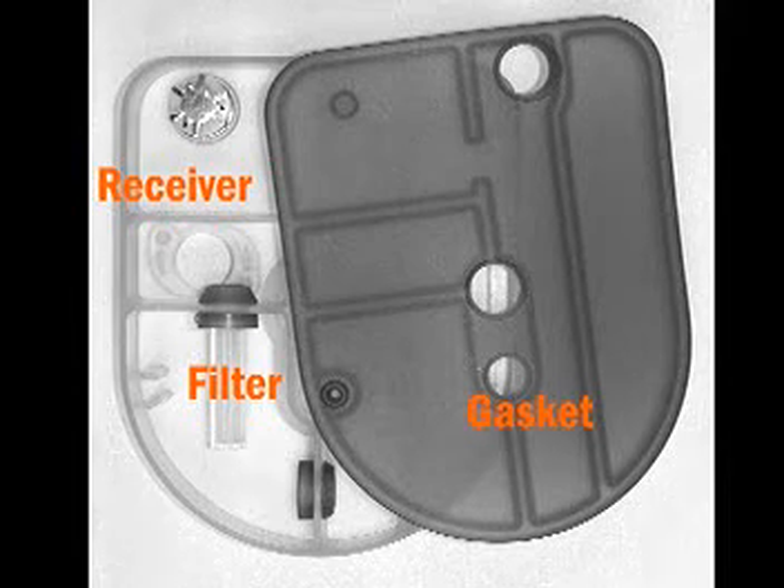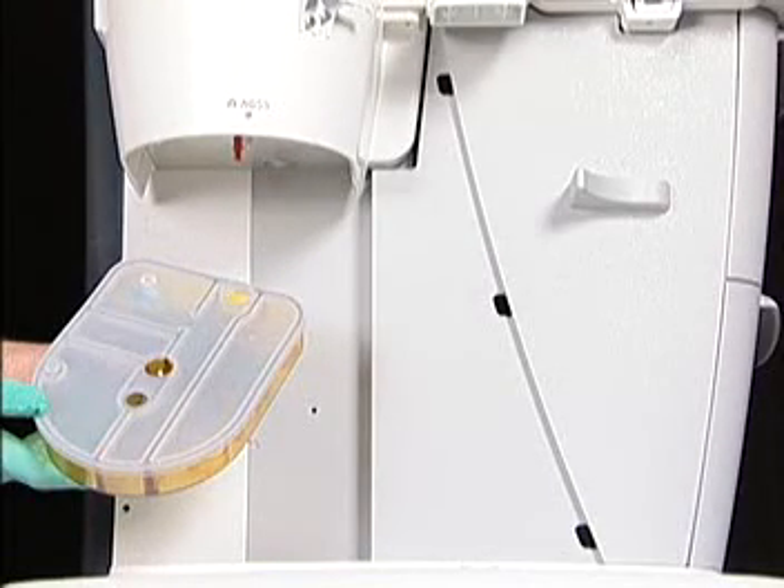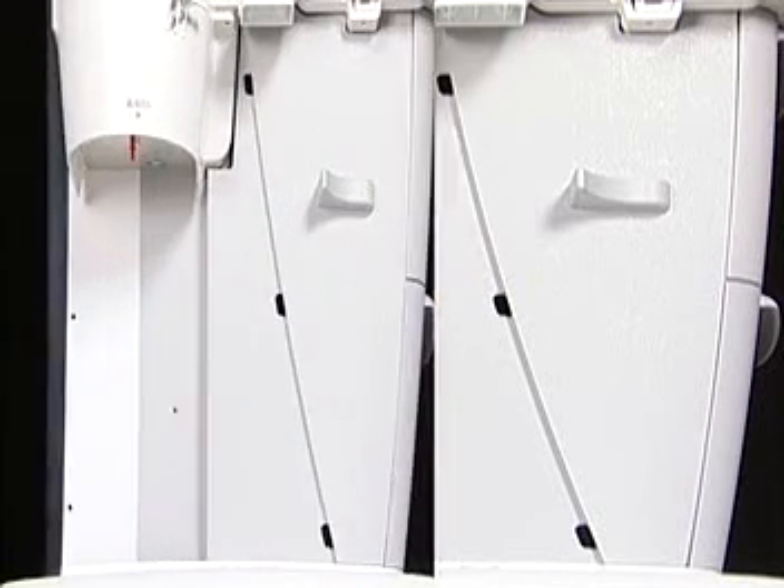To remove the filter, pull the flexible gasket from the receiver. Pull the filter out of its holder. After cleaning and reassembling the AGSS receiver, refer to the preoperative test in your user reference manual before using the system.